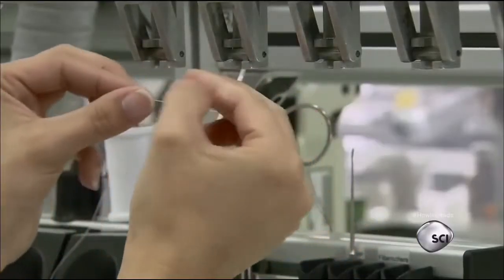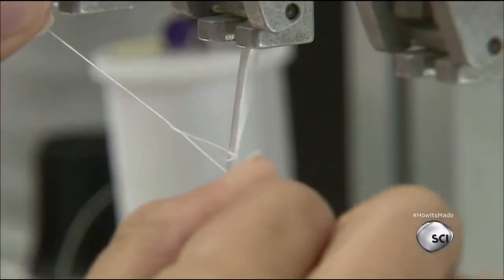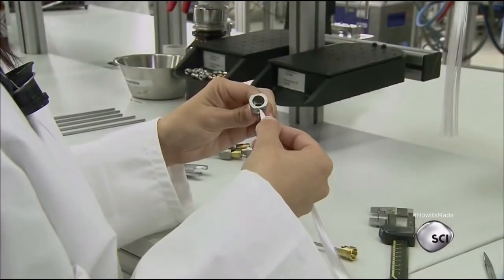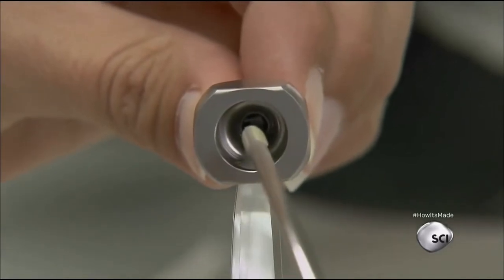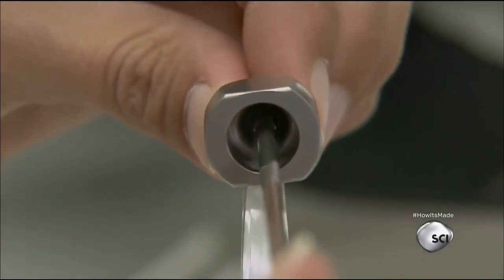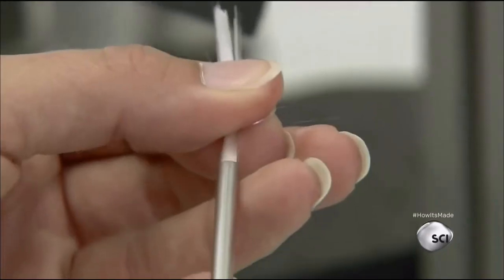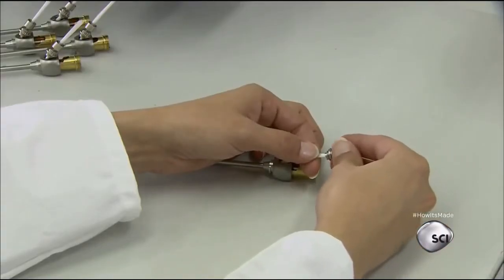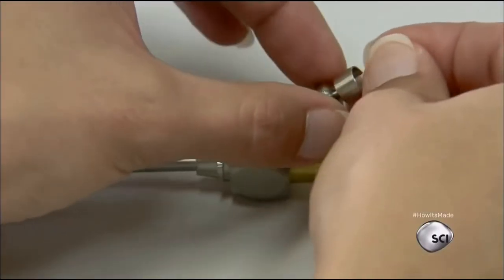After verifying that the diameter of the bundle is correct, they tie the optical fibers with string to hold them together during insertion. Then, workers insert the fiber bundle between the inner and outer stainless steel sheaths that make up the main body of the endoscope, pushing the fibers down the length of the inner sheath. They attach a stainless steel adapter. This will connect the light cable from the operating room light source to the endoscope, transferring light to the optical fibers inside the endoscope.